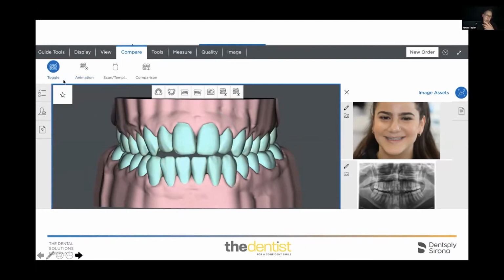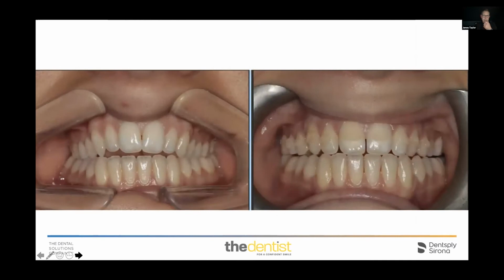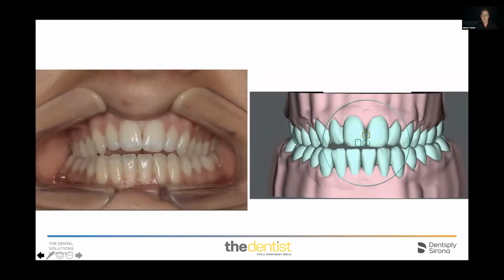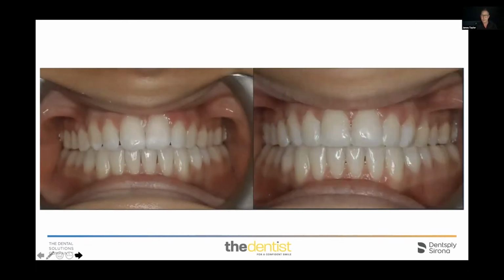She wanted a broader smile. She wanted bigger teeth. So the attachments went on at the top. And you see how the open bite's been reduced, how the gaps are opening between the teeth. This is after the end of orthodontic treatment. She'd also done some whitening at this point, and was proceeding with whitening. And you can see how the predicted before and after is what we achieved. So I'm getting realistic results from the aligners. It's as planned, which is really important.